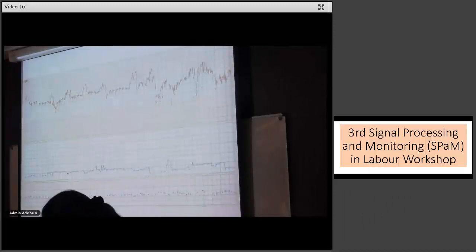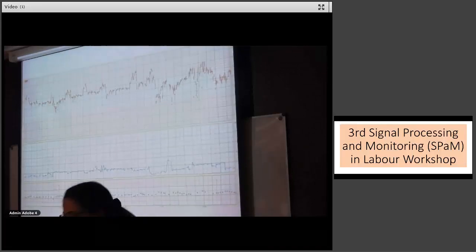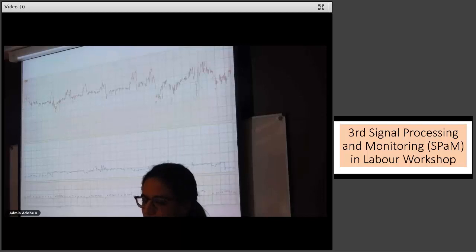I don't disagree with any of that. The point I'm making is, faced with this sort of scenario, I want to unpick each and every one of those parameters to just make sure that it is what I think it is. Otherwise, I'll be asking further questions. I agree with you in terms of the frequency of fevers related to epidural. In most Western capitals, that's roughly what it is. 95% of fevers in labor will be down to epidural, which is why I was making the joke about what happens in my homeland.